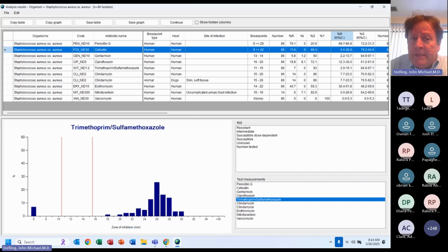If you're looking for resistance genes in humans, you still want to use the ECOFs. And in the animal, food, water world, they're all important. If you are doing testing for sick animals, using the animal-specific breakpoints makes sense. Or if you're getting samples from healthy animals with the objective of making breakpoints for the diseased animals, using the animal breakpoints makes sense.